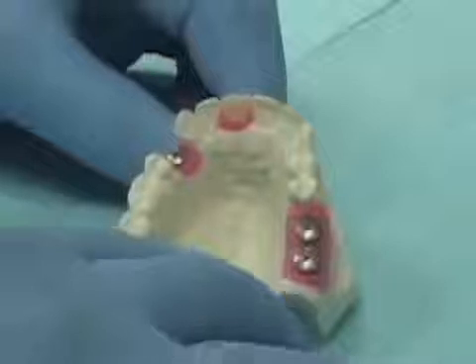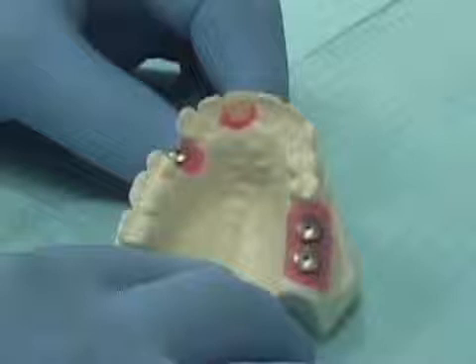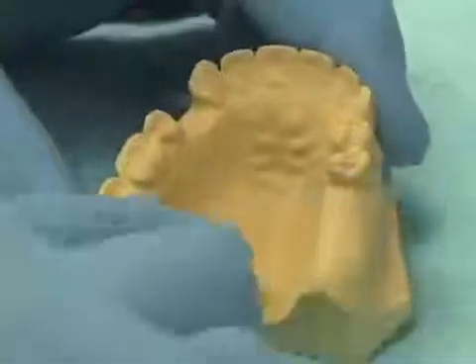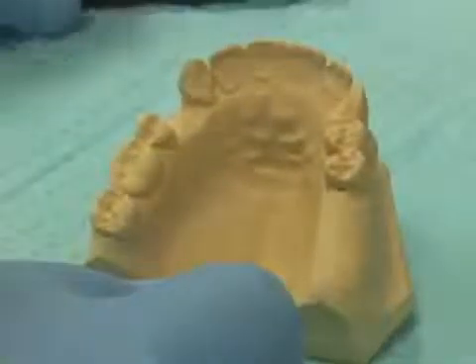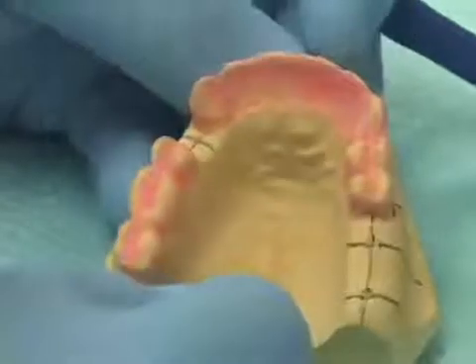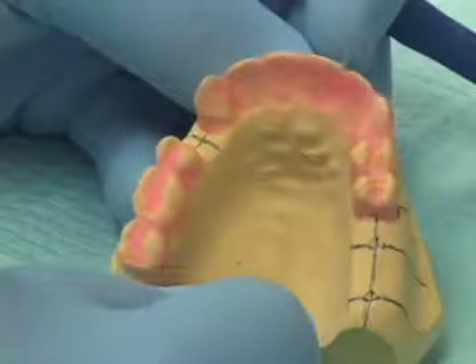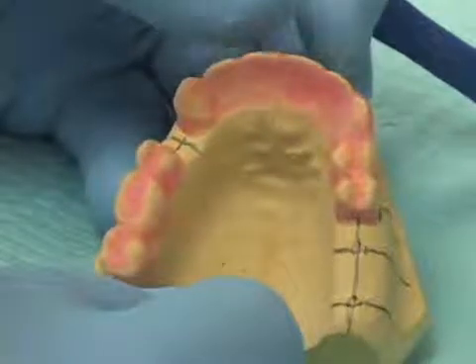For today's demonstration, we have our hypothetical patient and we have used our surgical guides to physically place the implants. In order to get to the place we are now, we remember that originally our patient had no implants in place, and we had a model of our patient. On our model, we determined the physical location of the implants and marked them, and then we blocked the model out so that we could make our X-ray guides followed by our surgical guides. So here's an example of a blocked out model for our patient.